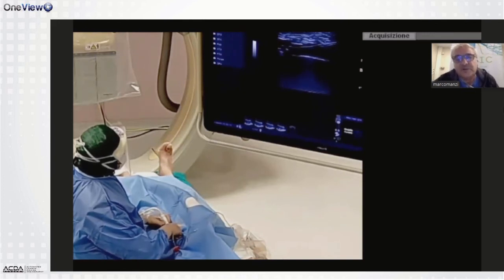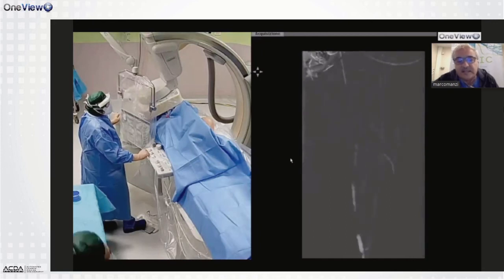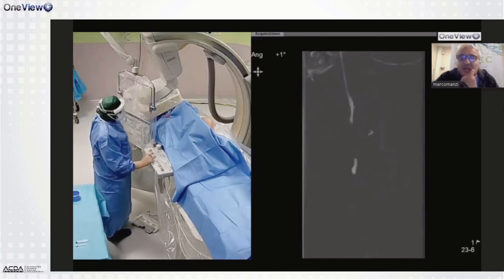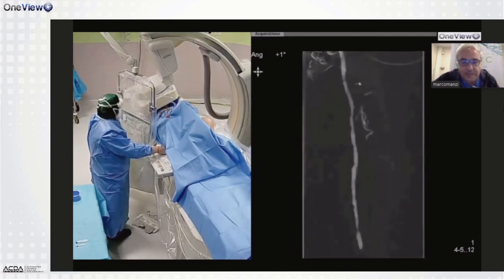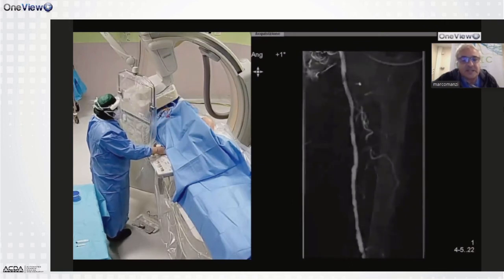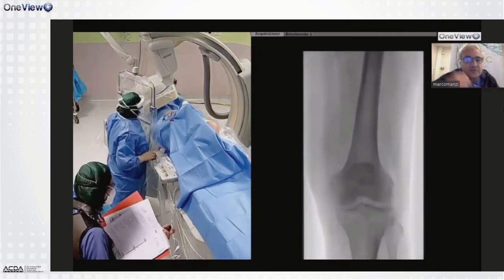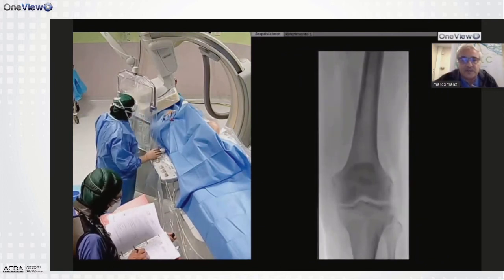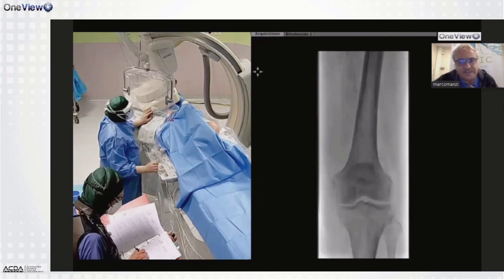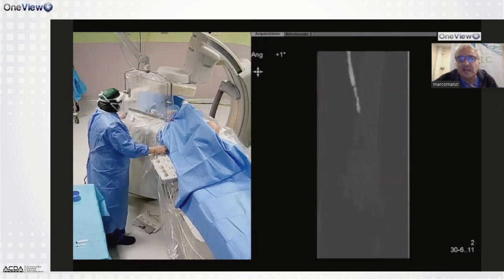Of course, the procedure begins with a puncture of the common femoral artery under ultrasound guidance. You can see here the injection directly from the sheath, with a bolus of 20 ml, I repeat, at 120 mmHg pressure. You can see the standardization of the procedure, just to train our brain and our eyes to interpret the imaging. This is the SFA with the same parameters and the same radiological projection, 30 degrees external oblique.